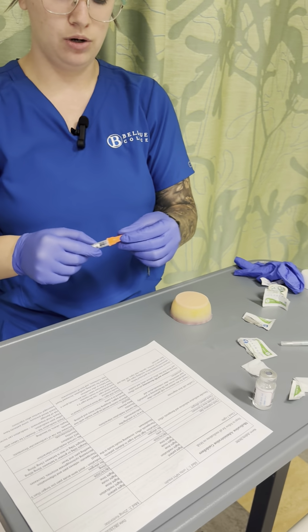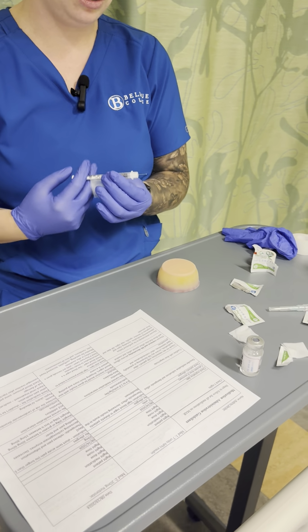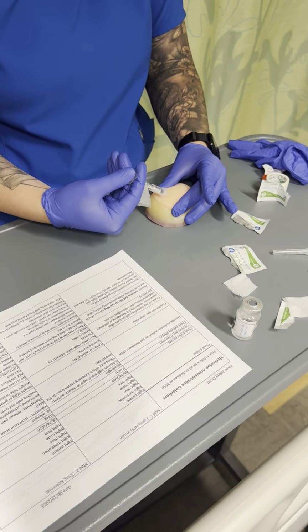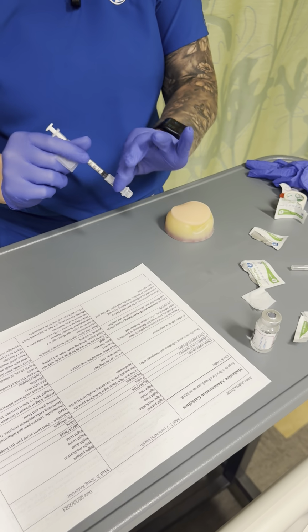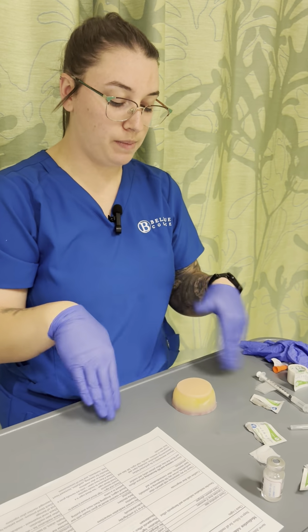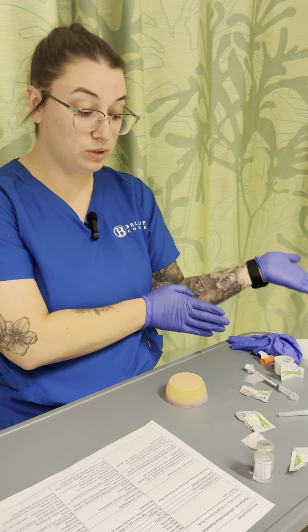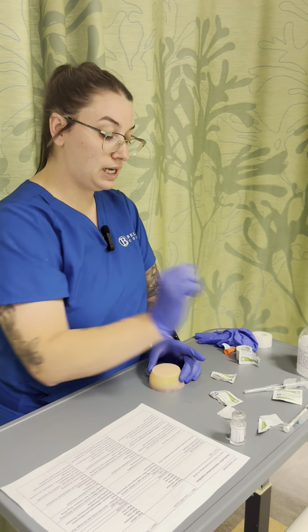Okay, and we are going to pull away. Make sure we pinch. If it's 1 inch, insert at 45 degrees. Okay. All right. If on a patient, I would make sure that I inspected the area and do it on the opposite side of what the previous medication was given. This would instantly go into a sharps container.